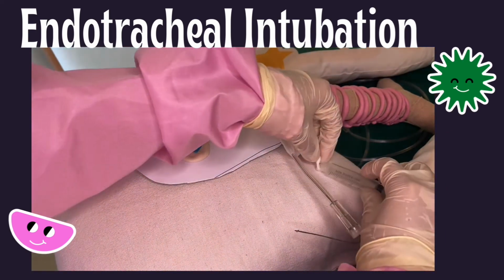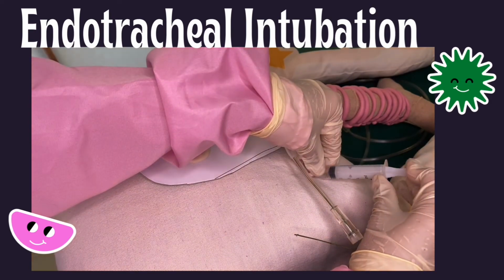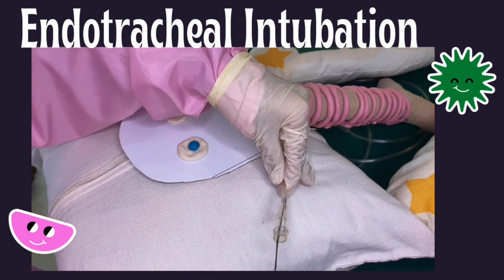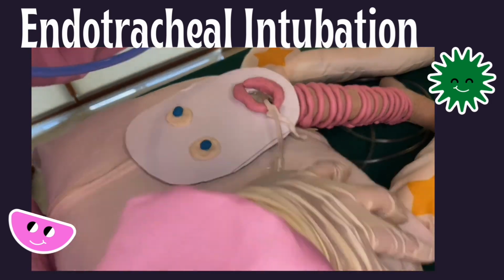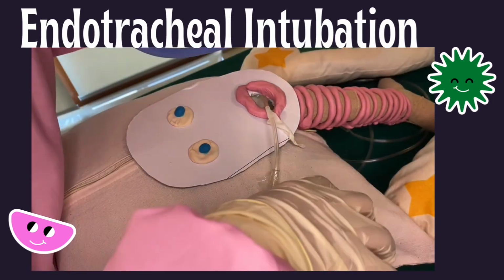Inflate the balloon with 10 cc of air. Then, remove the stylet and attach the tube to a bag valve or breathing circuit. While bagging, auscultate to evaluate the placement of the tube.